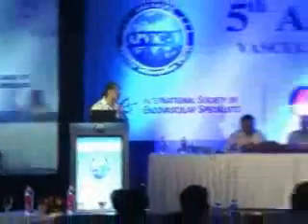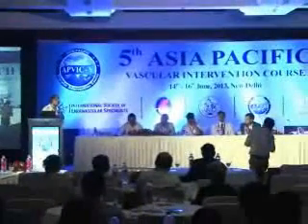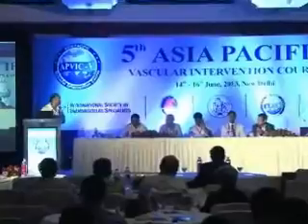So a simple wire perforation can lead to renal failure in a transplanted kidney, and here it occurred because of perforation by the PTCA wire during PTRA. Coil embolization is the treatment of choice in this case. And thank you. Like your first case, we had one around 2 weeks back. The patient had nephrolithotomy, and during that procedure, probably she had trauma. She had severe hematuria. She had to be given around 12 units of blood, and then we embolized the branch from where the pseudoaneurysm had formed, and the patient recovered.